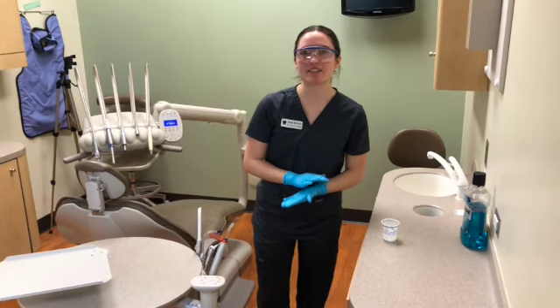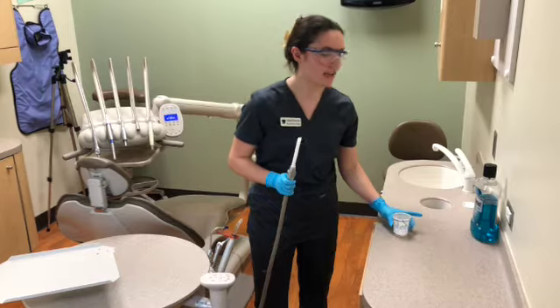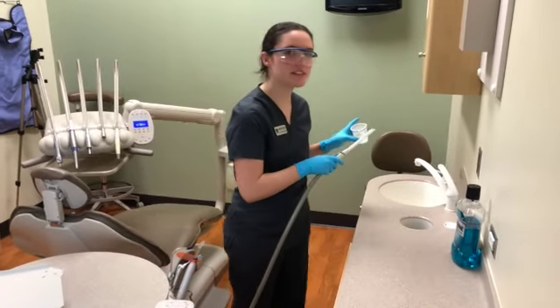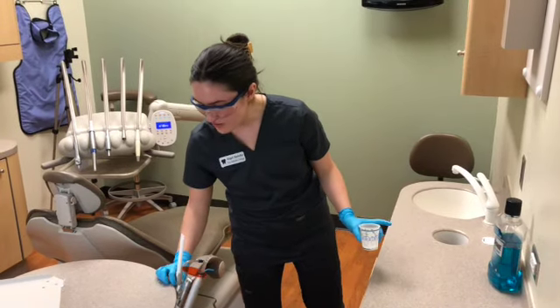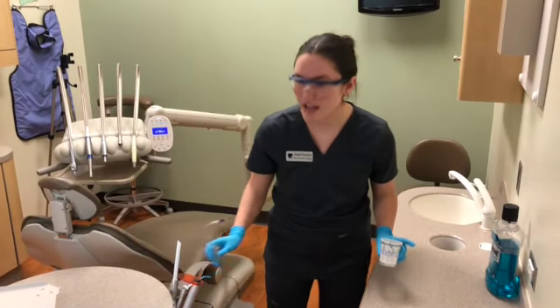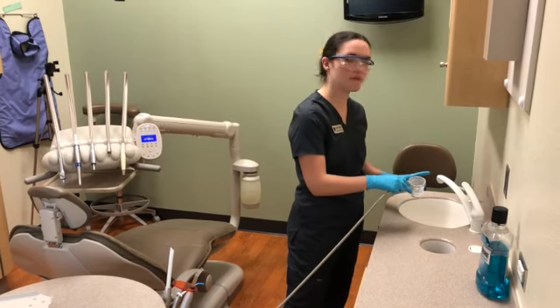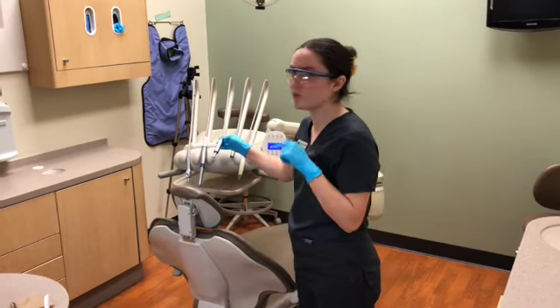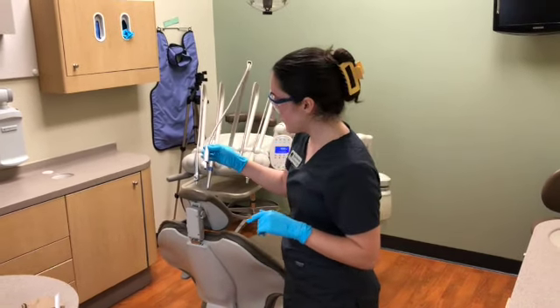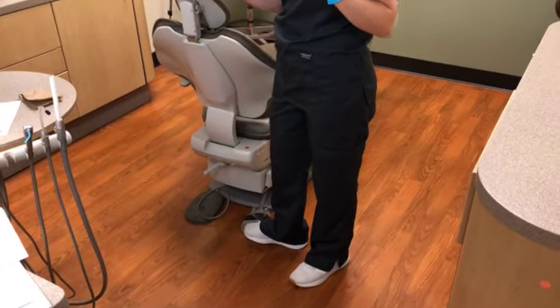And the next step would be to check the oral evacuator for suction strength. You would turn it on, and with a cup filled with water, you would check the suction strength over a sink. And then you would also do the same process for the saliva ejector. You would check the suction strength after you've turned it on in the cup of water. And now we will check the low-speed handpiece by attaching the rotary instrument, and then we would check for rotation and air pressure by pressing on the rheostat.